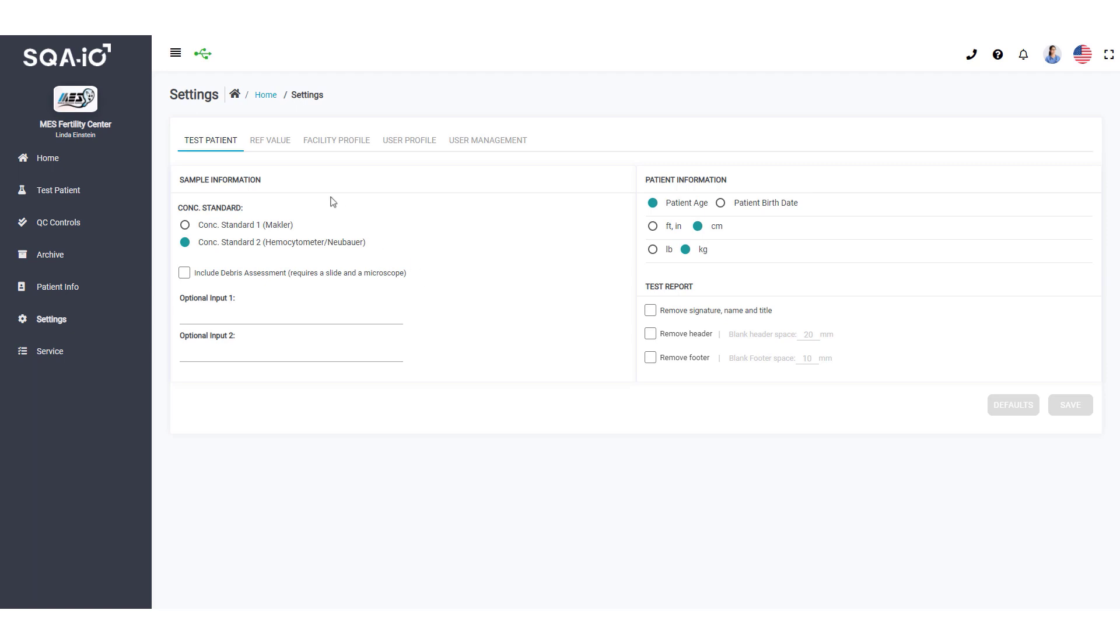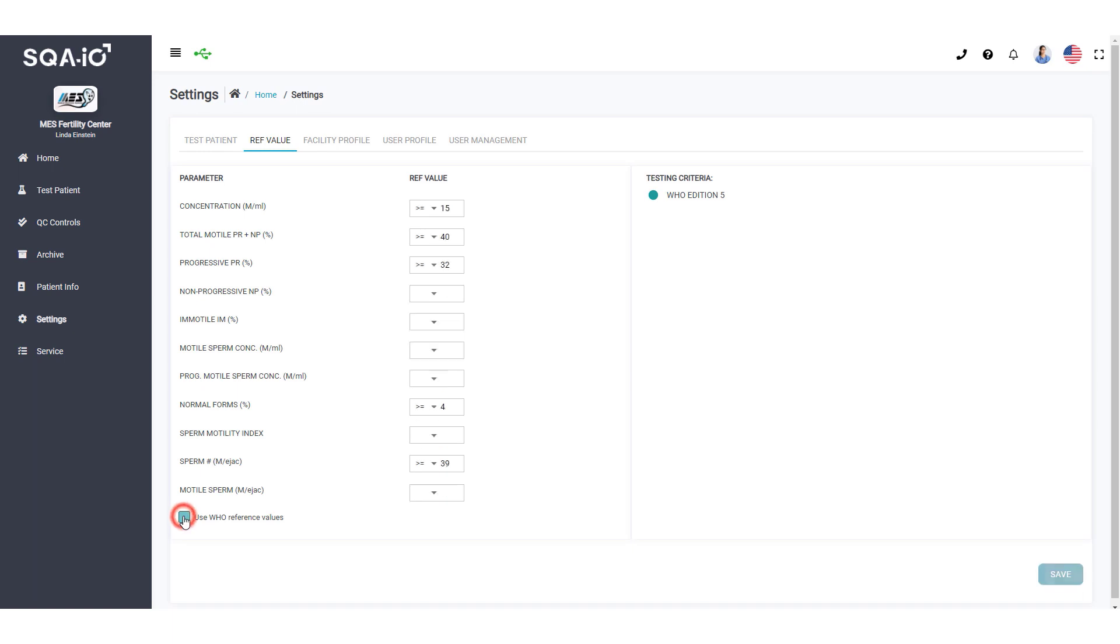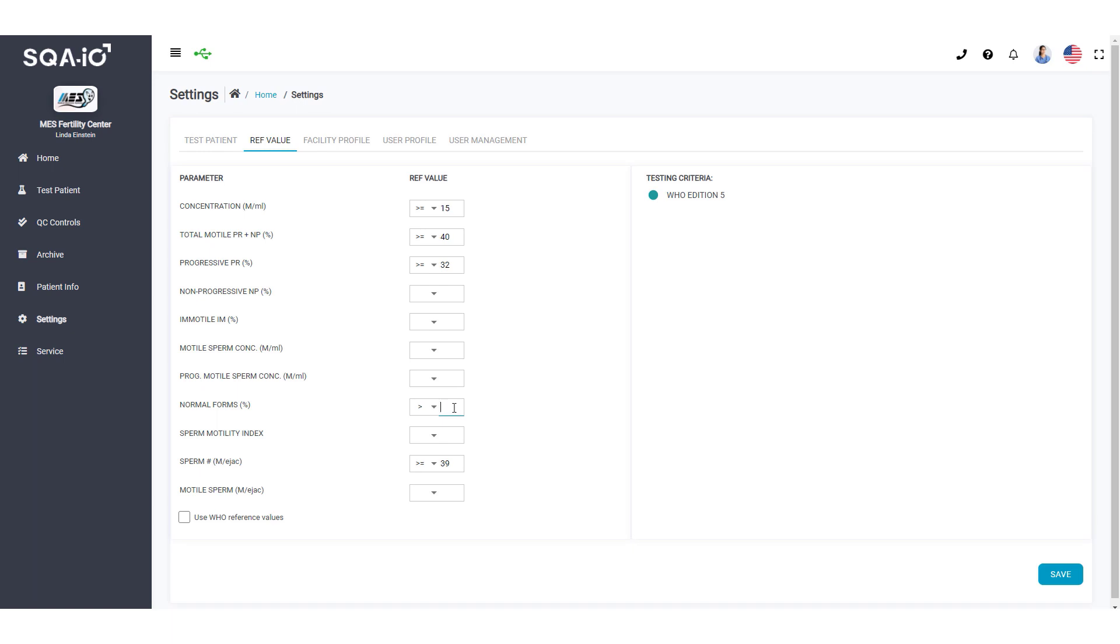Set the reference values for semen test results based on WHO or based on laboratory protocols and preferences. Make sure to save your changes.